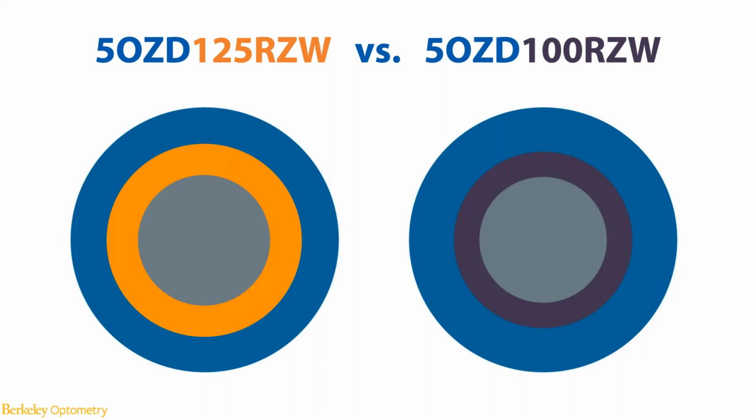So related to this study, we aim to answer the following questions. Number 1, how reliable is the change on the lens design being reflected on the change of the corneal shape? After all, it's the shape of the cornea that matters in the patient's daytime vision for Ortho-K modality, not that of the lens. The second question is, what other factors other than the optic zone diameter play roles in determining the post-Ortho-K corneal shape? And number 3, if there are multiple factors at play together, what are the underlying interacting mechanisms of having these significant interactions?